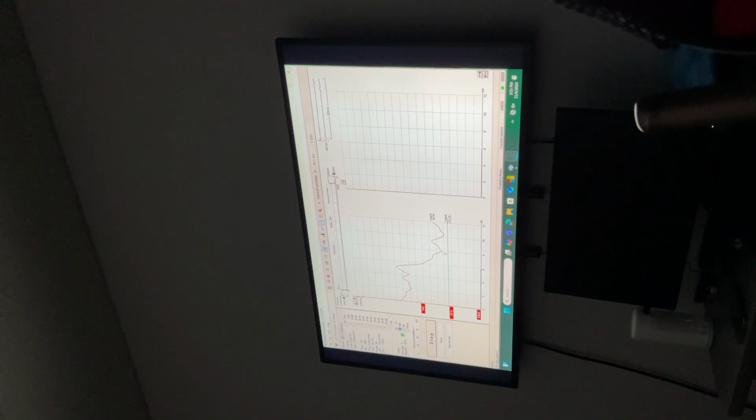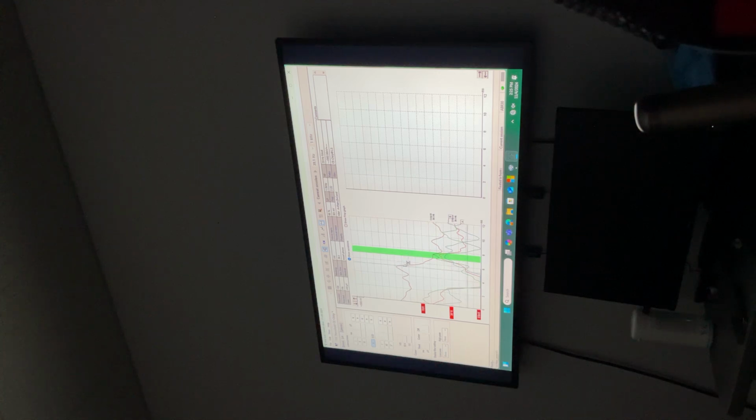It's so big now, so this is wave 5. I don't know why the normative latency is off. I have to look at the latency settings. So this is 5. This is broadband chirp 5.13. I'll just put it here.